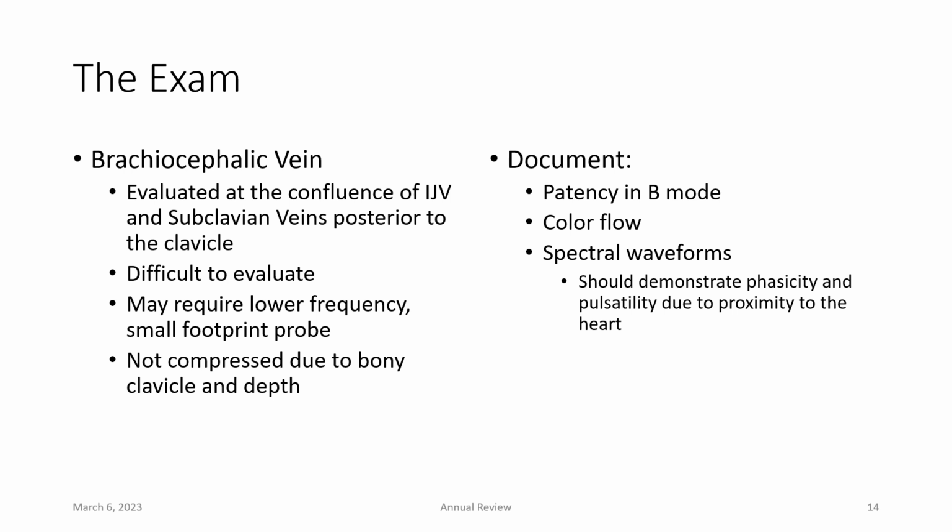And then finally, you'll want to do spectral waveforms. Now, this should again demonstrate phasicity, but you will also definitely see pulsatility in this as well, due again to the proximity of the heart.